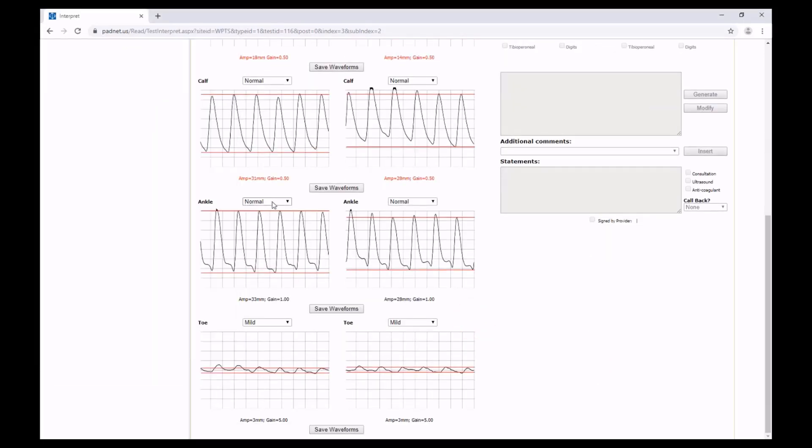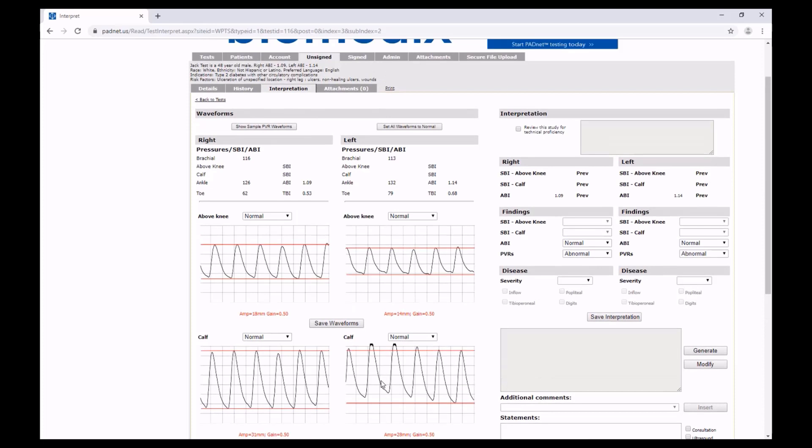Now once you've added your interpretation to all of your waveforms, you can click any one of these Save waveform buttons. No need to select all of them.